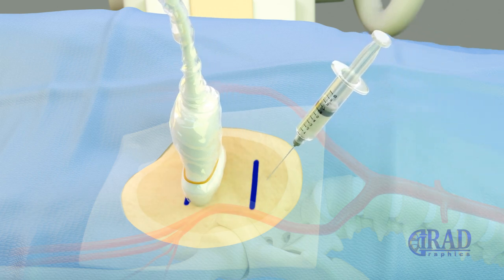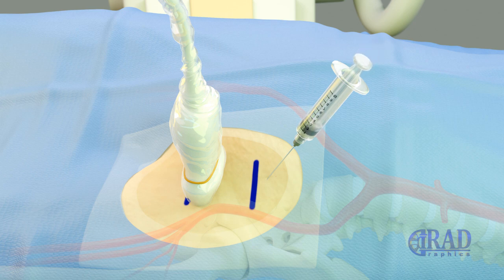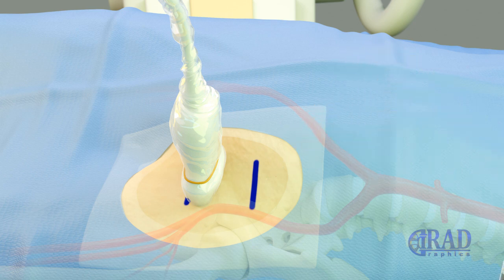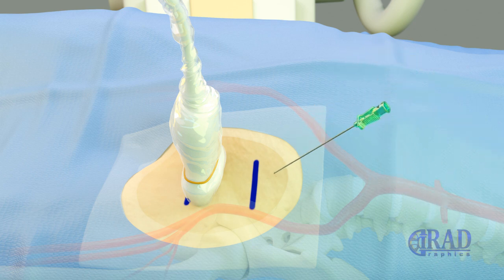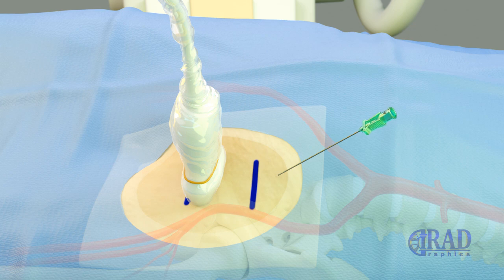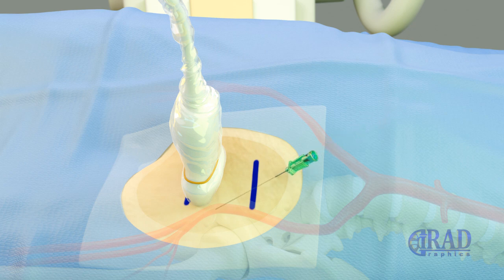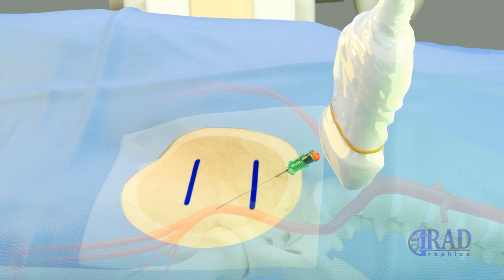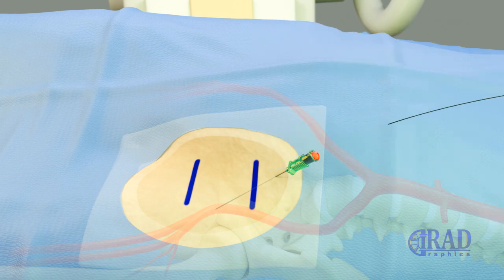Next, the ipsilateral common femoral artery is accessed under ultrasound guidance using a micropuncture needle directed toward the target artery affected by atherosclerotic disease, which causes symptomatic narrowing and disrupted blood flow.